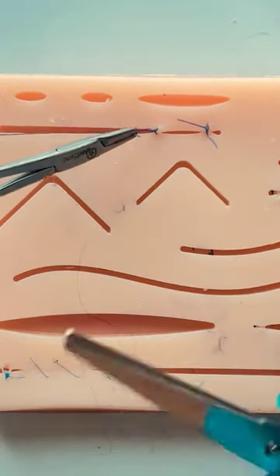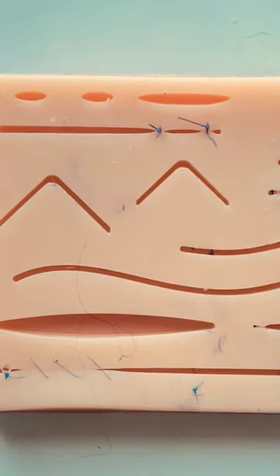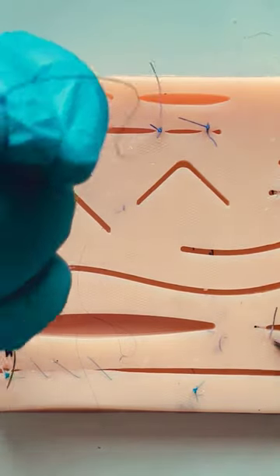You can learn some of our easy techniques to suture fast, whilst maintaining precision, in the bite-size videos below.